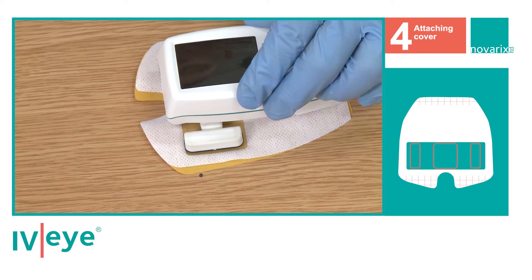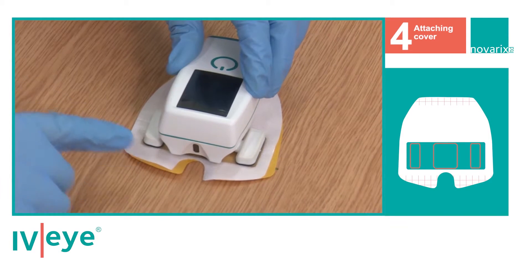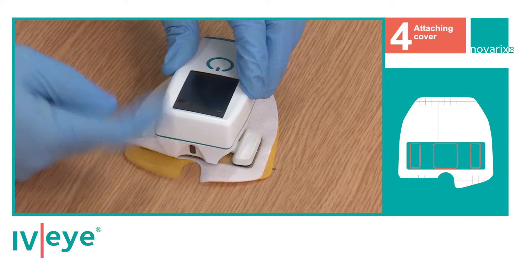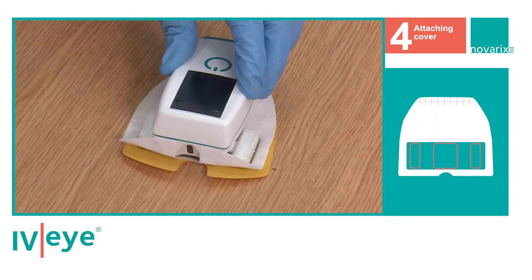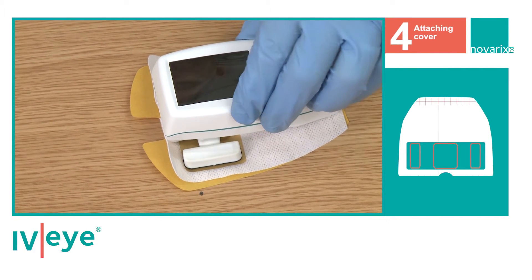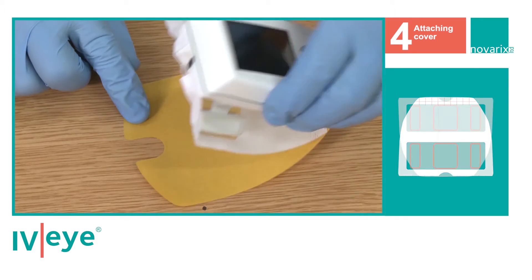Once the IVI is face down on the disposable cover, fold the outer sticky front edges of the cover onto the front sides of the IVI device. Now the disposable cover is attached. Turn the IVI over and inspect the attachment.